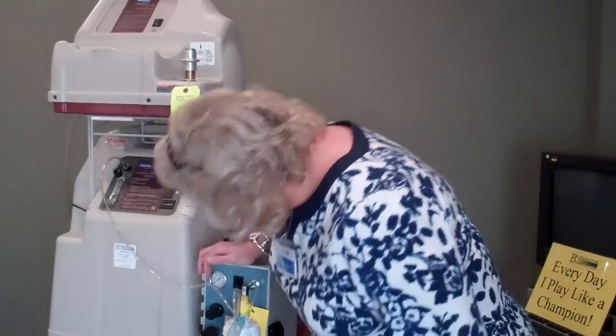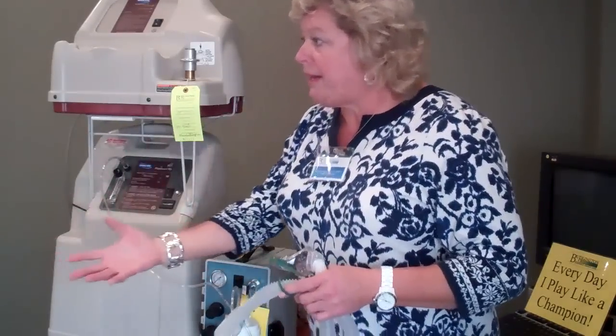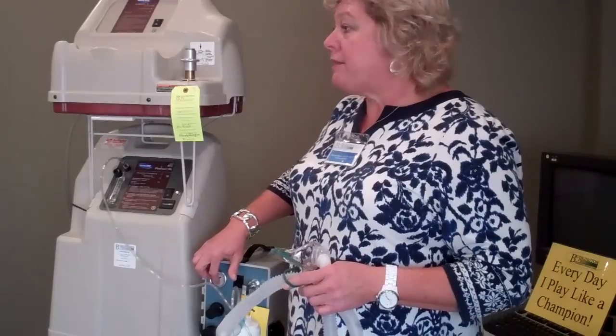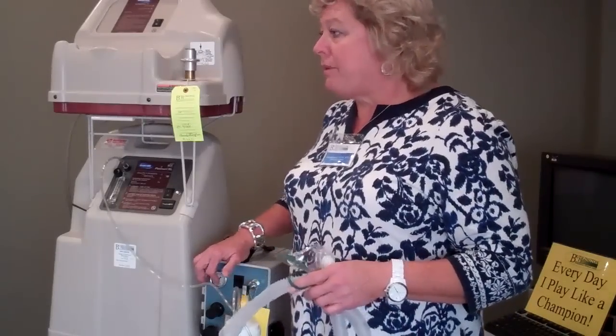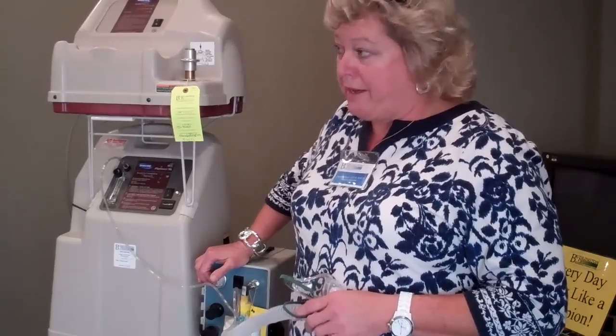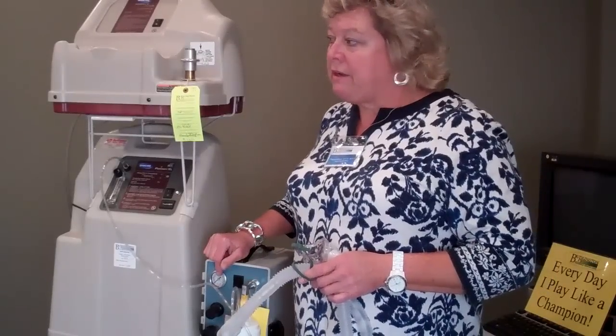The machine has a PSI gauge that regulates how much pressure it's putting out per square inch. If I want to deliver more mist to a patient because they're drying out, I can increase this pressure to a higher number. But if I increase it way too high, I can drown my patient — I can overhydrate them, and that's not something we want to do. So it's really important that when we set these up, the PSI gauges are set around 26 to 28. We don't really want to go any higher than that.